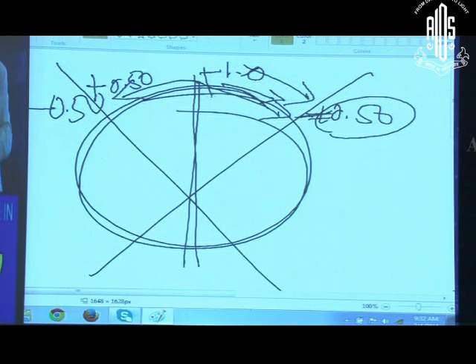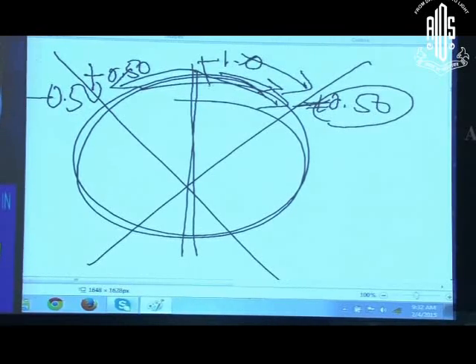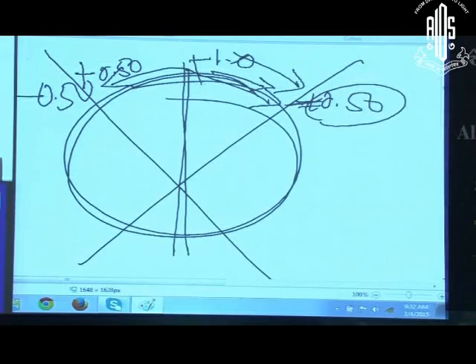Okay, in that new axis of 80 degrees, again you can straddle it, 45 on either side. Again check, till both the flips, both the times, he reports no further improvement. Okay, this is refining the axis. This is just a small idea, you need to do it yourself and learn.